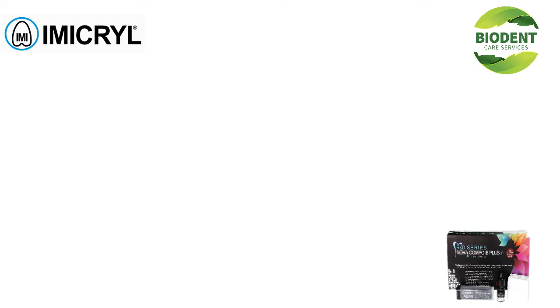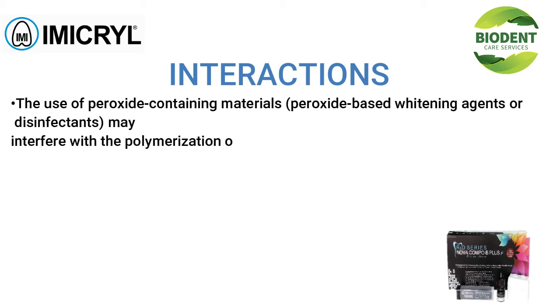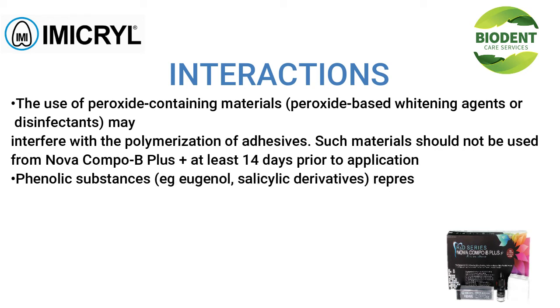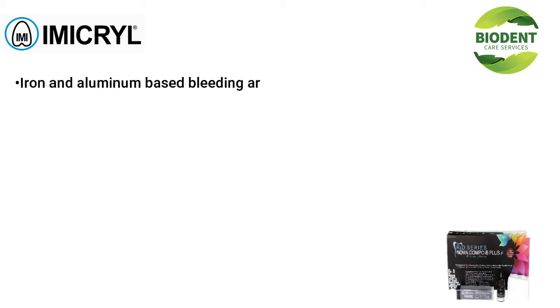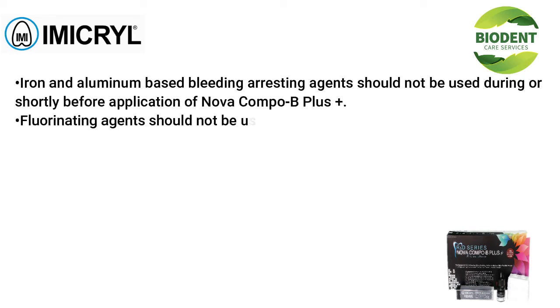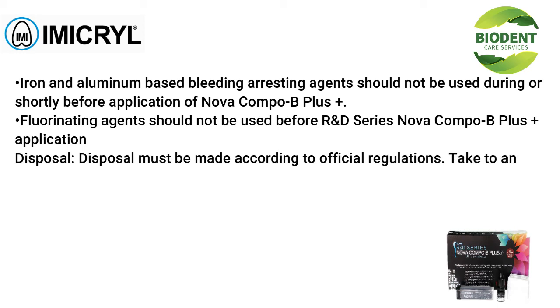Interactions: the use of peroxide-containing materials, peroxide-based whitening agents or disinfectants may interfere with the polymerization of adhesives. Such materials should not be used for at least 14 days prior to application of Nova Compo B+. Phenolic substances, e.g. eugenol, salicylic derivatives, repress the polymerization of Nova Compo B+. Iron and aluminum-based bleeding arresting agents should not be used during or shortly before application of Nova Compo B+. Fluorinating agents should not be used before R&D Series Nova Compo B+ application.